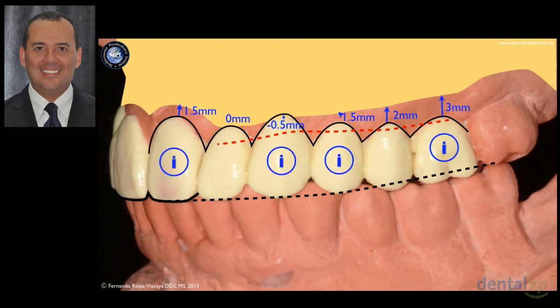I want to place implants according to the protocol that I learned in central, canine, first premolar and first molar, and ovate pontic in lateral and second premolar. And I want to fabricate 4 fixed partial dentures, from central to canine and from first premolar to first molar.